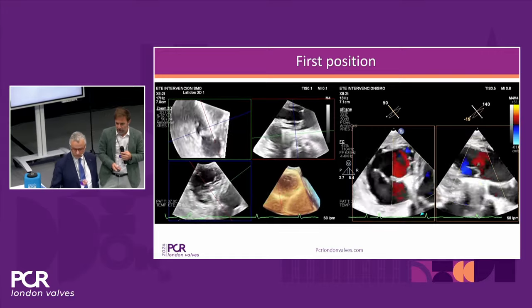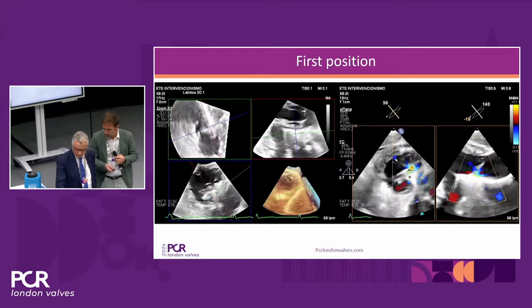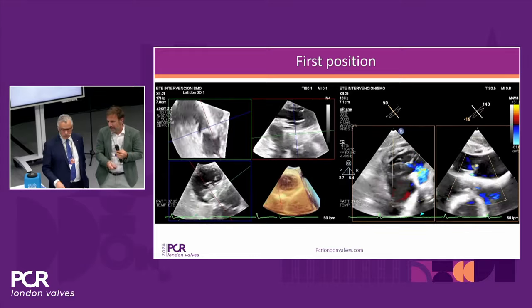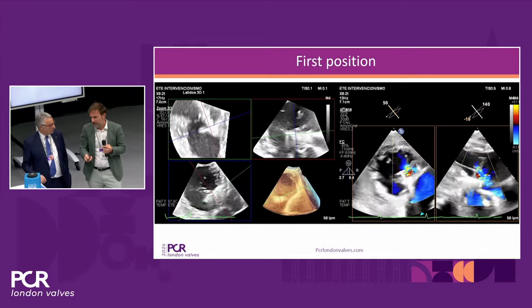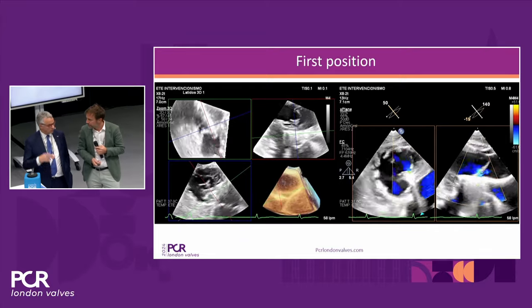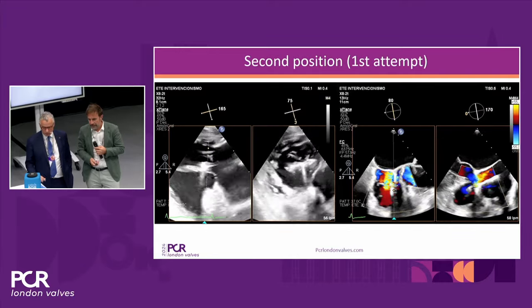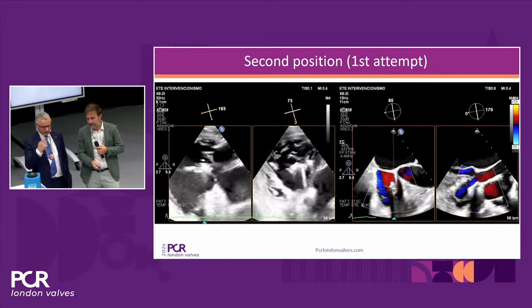So that's the reason why. Maybe in other cases, where there was annular dilatation, we leave this clip to work after, behind, but we didn't think that this was a good idea because we weren't gaining anything with this clip. So what did you do then? So we switched the position. Okay, let's see, what did you do? So you target the lesion then.